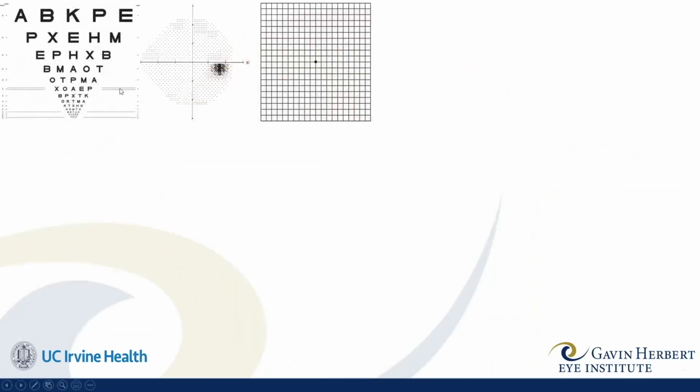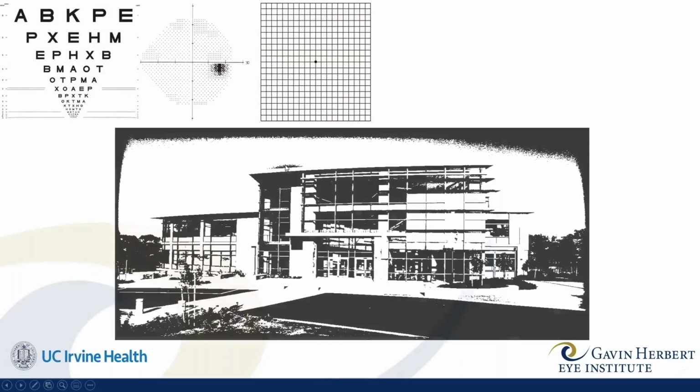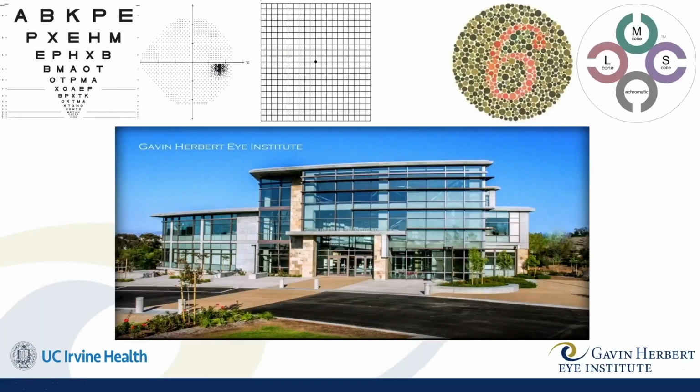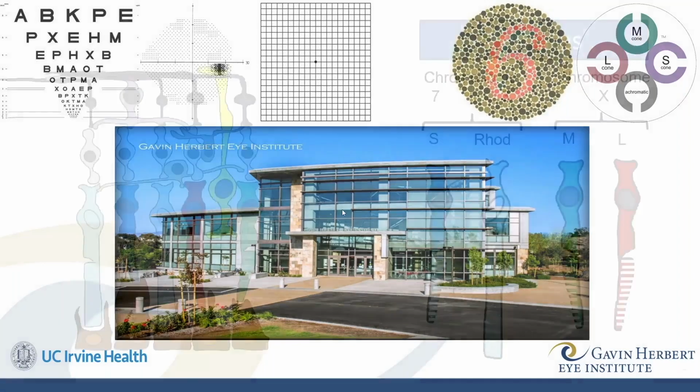So these tests are all black and white, as you can see. And if every day I walked into a building that looked like this, that would be fine. But this is the Gavin Herbert Eye Institute where I work, and it's in color. And there's many hues, and there's contrast, and there's many other elements to vision that are important. And so when we think of color vision testing, we of course think of the Ishihara color plates. And today I'm going to be talking about cone contrast threshold testing.